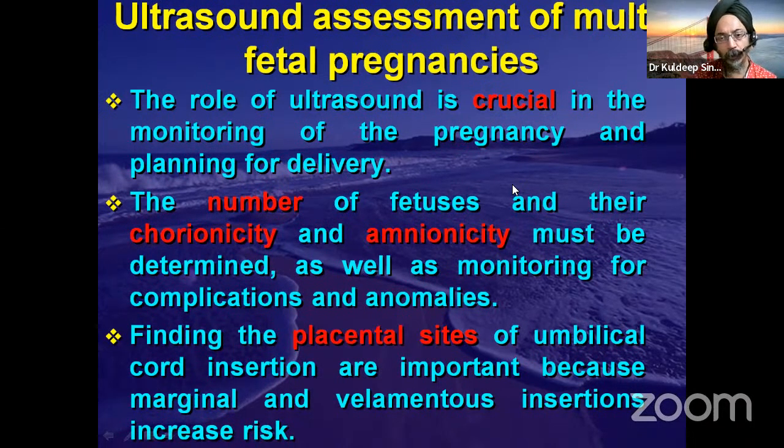MCMA, yes. Conjoined twins, we're not going to be looking at straight away, but yes, in terms of the frequency and in terms of complications, we need to be careful on the monochorionic, monoamniotic. And the least of the complications is going to be in which one? Perfect, in the DCDA. So that is why for the chorionicity and amnionicity, I need to know what type of twin pregnancy it is. I need to know what I have to counsel the patient, what sort of information the obstetrician is going to be asking. So we need to be aware of that.